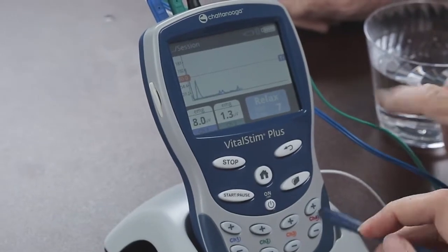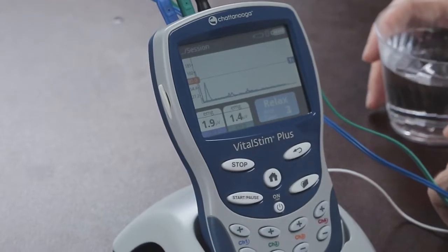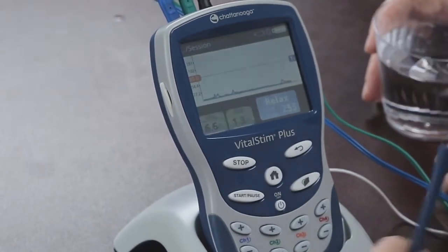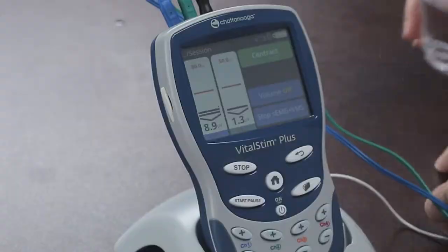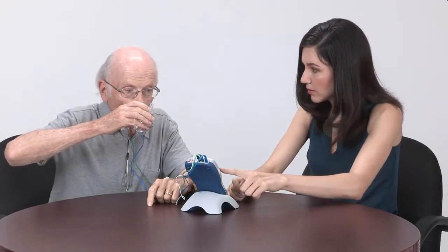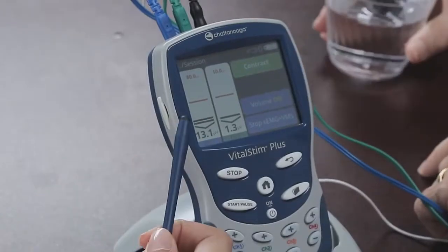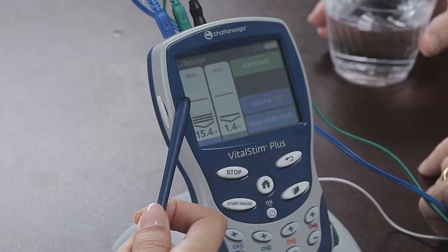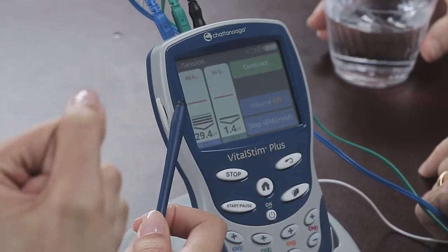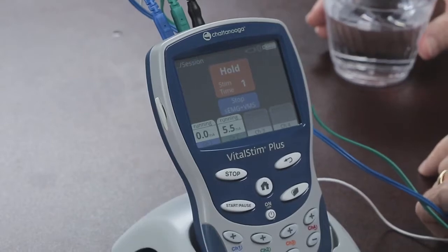In relax mode, the instructions will be provided to the patient to say, okay, get ready. You're going to be asked to swallow. When you get the swallow going, try and put in a big effort to reach the threshold. When you reach the threshold, hold it and hold it and hold it for the right amount of time. Once this is done and executed, the patient repeats this cycle as many times as is therapeutic. And this concludes this video tutorial.